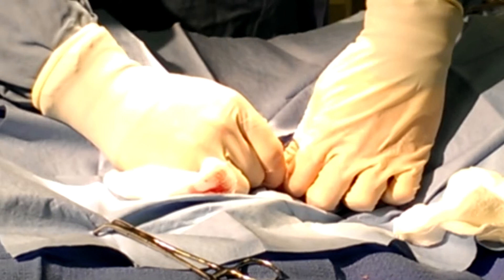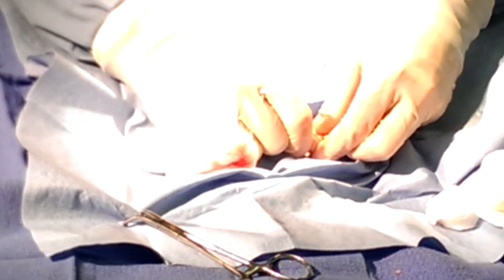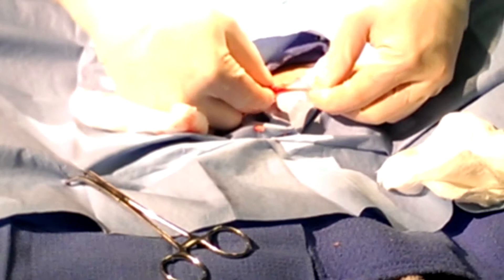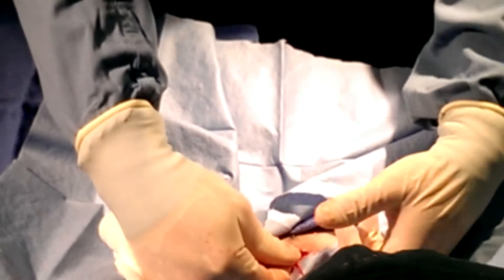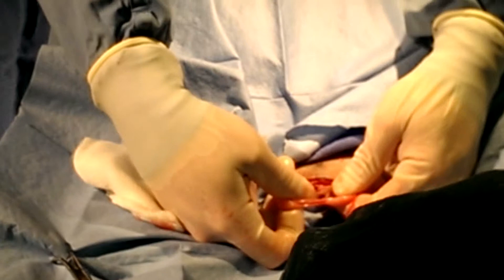The more you tear and pull and snap those veins, the more they realize they've been cut. This is a pretty tight ligament — ready? On three: one, two, three — pop. That was it. Is it bigger and thicker with a larger dog? Oh, absolutely. This is the remnant of that ligament I just broke. So: suspensory ligament, ovary, and this is called the proper ligament of the ovary where the uterine horn attaches to the ovary.